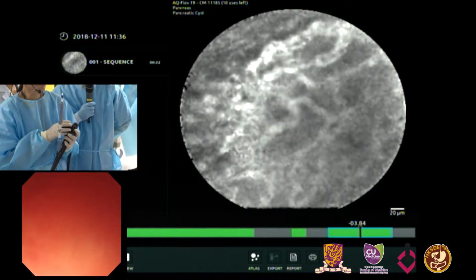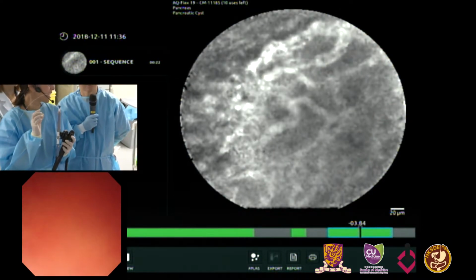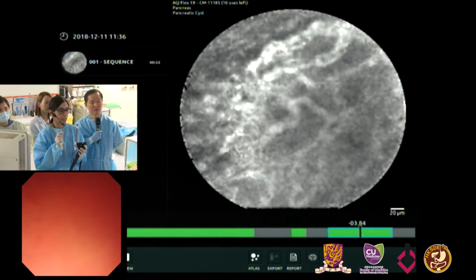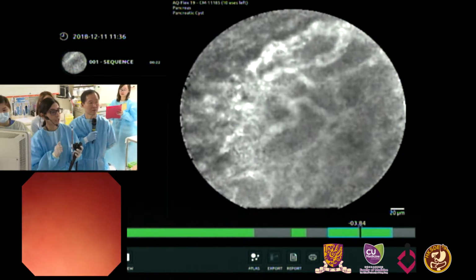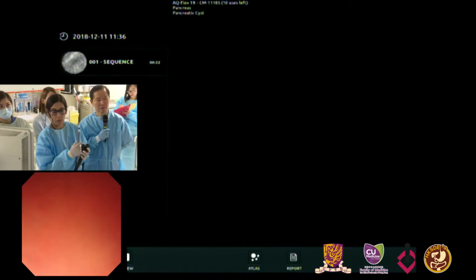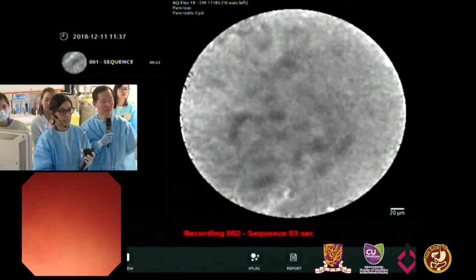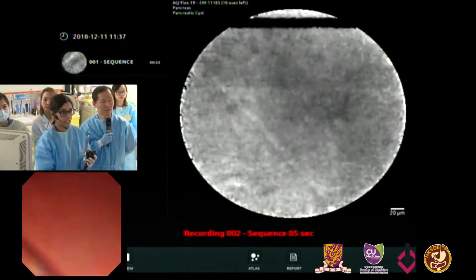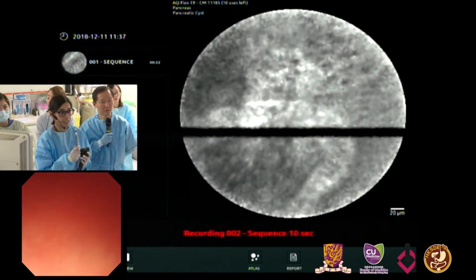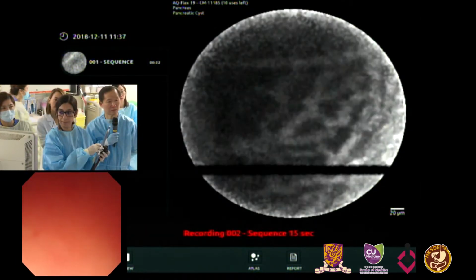Although it's interesting, Uzma, you brought up serous cystadenoma because there is an imaging criterion, a superficial vascular network that Napoleon described in endoscopy in 2015 for serous cystadenomas. But you can also sometimes just see some vascularity on the cyst wall. But it's a little bit of hit or miss, for sure, with confocal. And I'll be honest, we probably don't use it as much as we did in the early stages. But papillary projections are very specific if I can find them. So I try to just scan the wall a little bit.